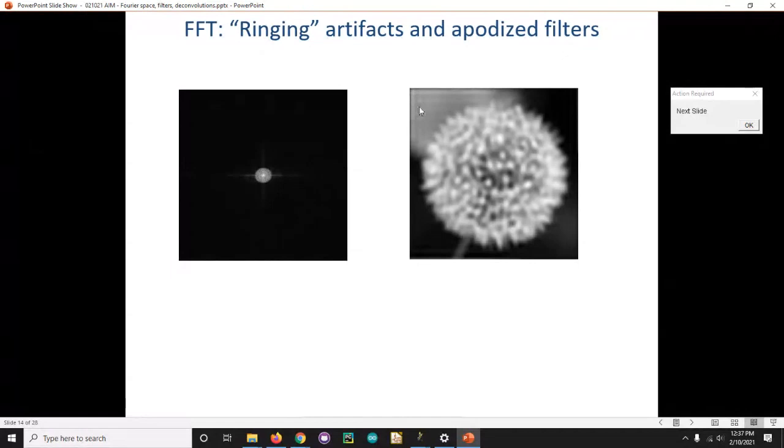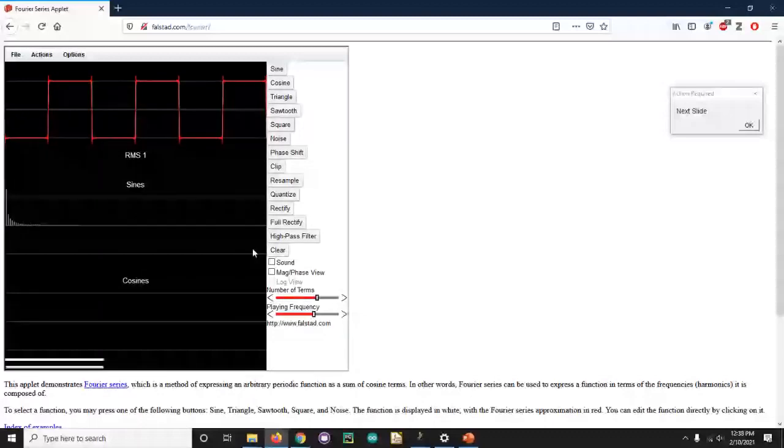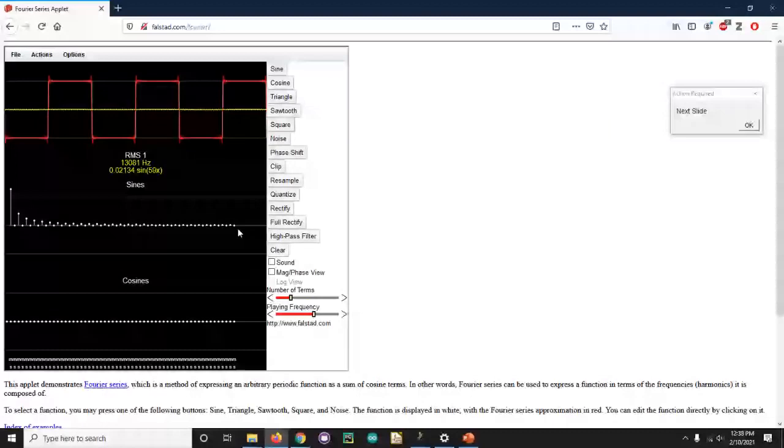So if you go back to our original, nice, clean, one-dimensional example, we can see that same ringing artifact here. We get the overshoot and undershoot at these boundaries. But you can also see as we add more and more terms, that overshoot and undershoot start to get tighter and tighter. What's happening is we're cropping the highest frequency, and past that we don't have even higher frequencies to tighten that over-representation of the highest frequency sine wave. As a result, wherever our Fourier transform is cropped, we get this overshoot.